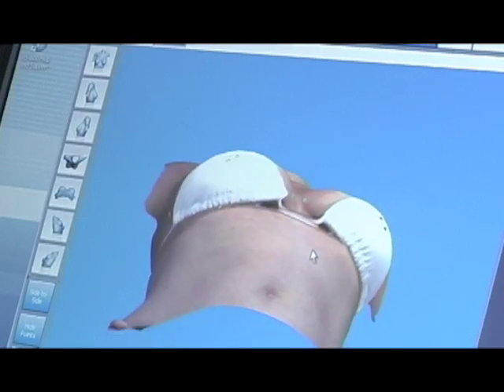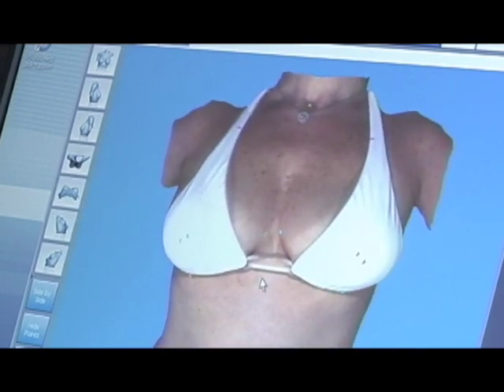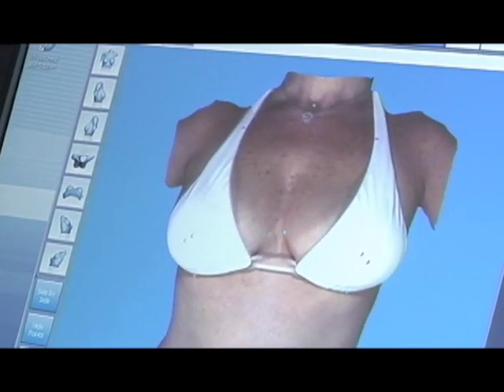Now we want to check our marks, look at them from different directions to make sure they're all in about the right position. The computer will use these marks to determine where the breast itself is, and based on that, where it should place the breast implant.